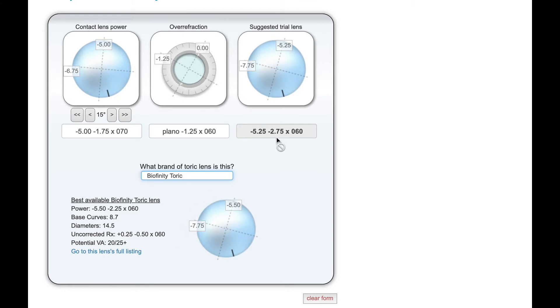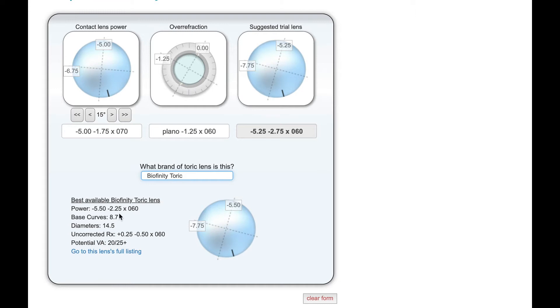So our suggested lens now is a 2.75, but a lot of lenses don't go that high, including the bioaffinity toric lens. So what it does is it makes an adjustment instead of 2.75, it just finds the highest cyl power or the closest cyl power it can, which is a 2.25. And then to make up for the change in the cyl power, it adds a quarter to the sphere to keep the spherical equivalent.